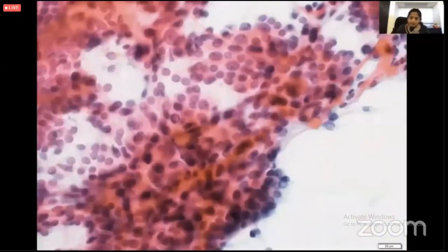So that stops with all the different neoplasms. I haven't covered more of the atypical and NIFTP category in this session. I have just gone with the basic idea of how I approach from benign to malignant and what criteria I use in my daily practice.